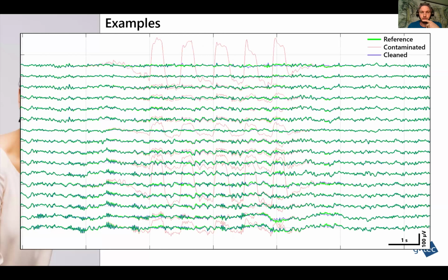So before we go into the quantitative analysis, let me show you a few examples. This is a time course of 16 channels EEG, where green is the reference, red is contaminated, so you can clearly see that we have some, I guess, EOG artifacts over there. And when we apply Oscar Pro, then we get the clean signals in blue. And already visually you see how well the clean signal matches the reference signal. So that's a quite nice output.